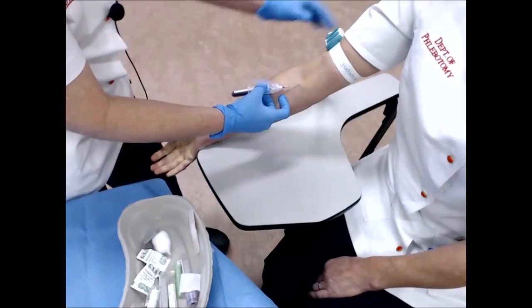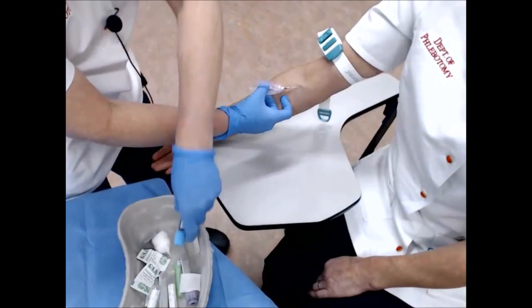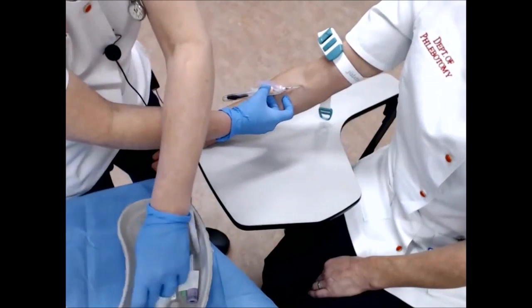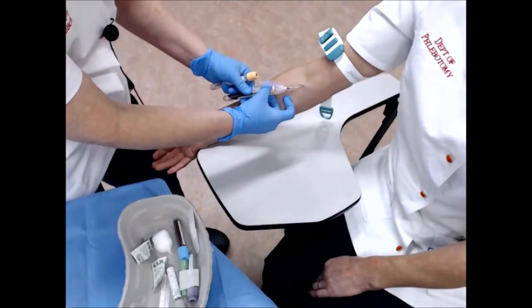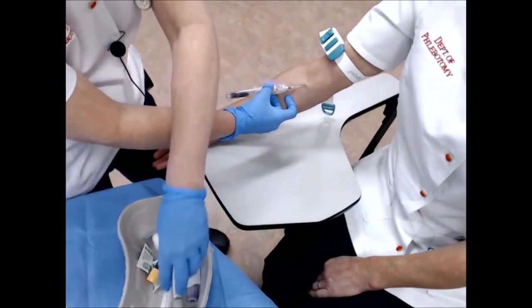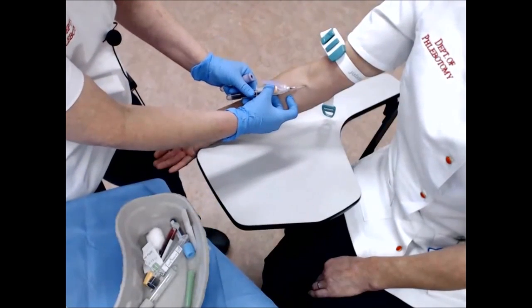You can see the flash in the top of the needle. I have the patient relax their hand and I relax the tourniquet. Then, using the proper order of draw — coagulation first, then the yellow top bottles — I invert each tube five to eight times to ensure the additives are mixed properly into the blood.